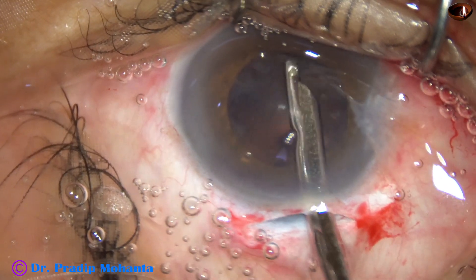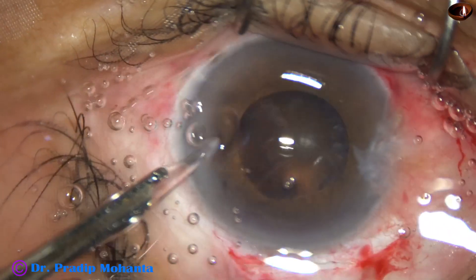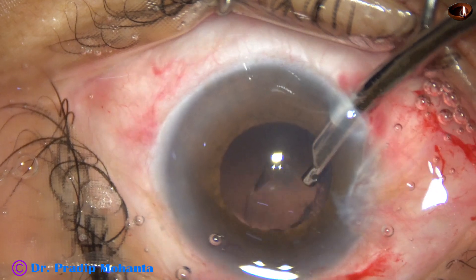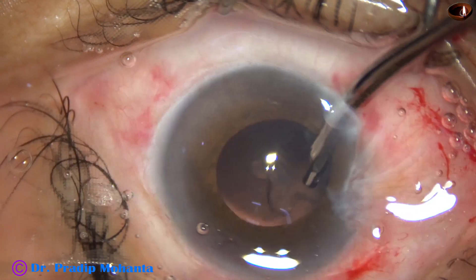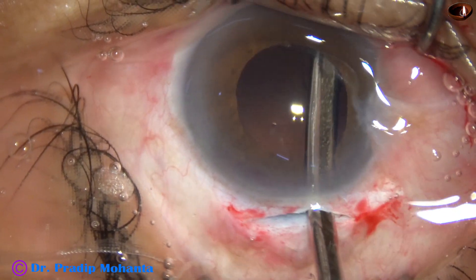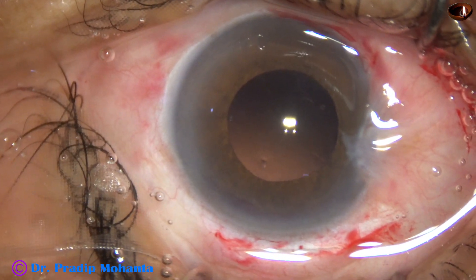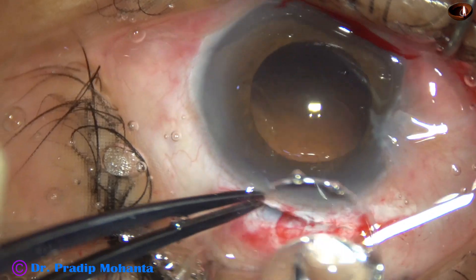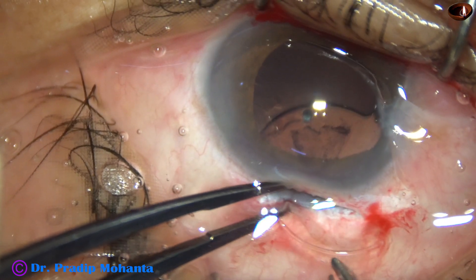This is a 22-gauge Simcoe cannula. This side port is very small; this one is okay. Go through the 7 o'clock side port and remove most of the cortex. A bit of cortex is still there at 7 o'clock — remove it going through the main wound. Inject visco. We can implant a foldable lens, but in this case I implanted a Liberty lens from Appa Samy Associates.